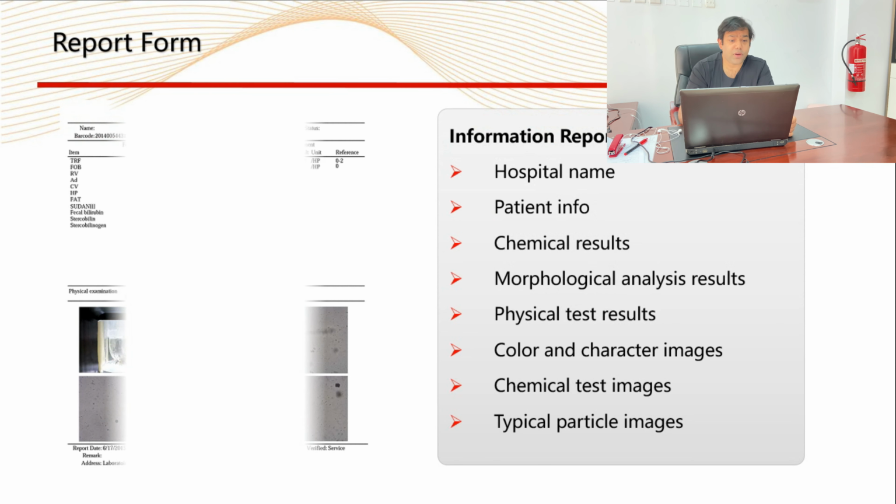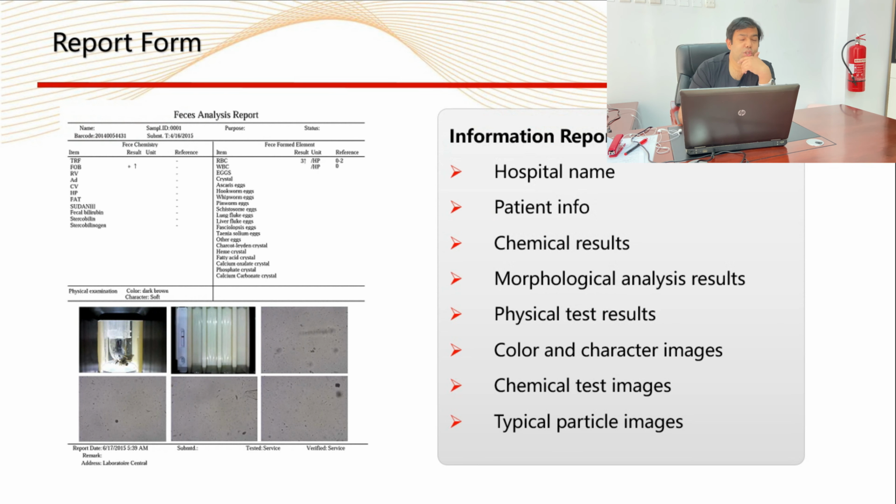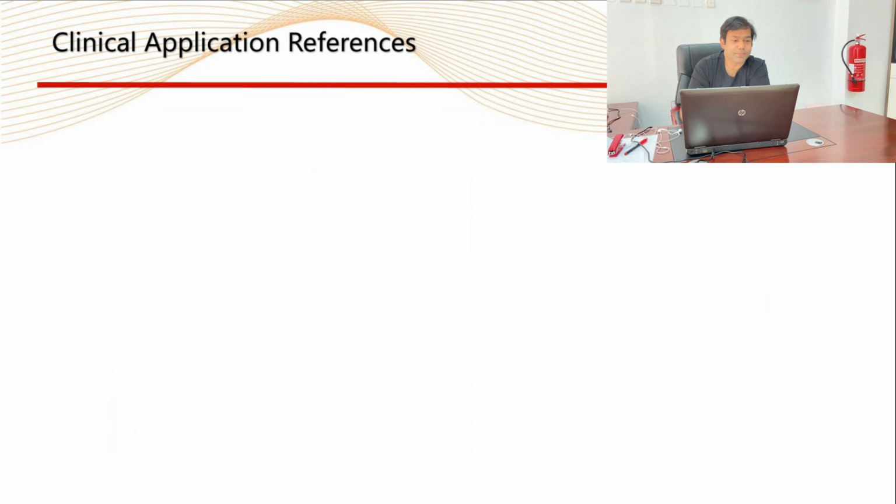And this is the report form. I will show you the patient report, how it will looks like. Later on I will show you the report as well. And in this report you will find such kind of information like hospital name, patient info, chemical results, and so on.